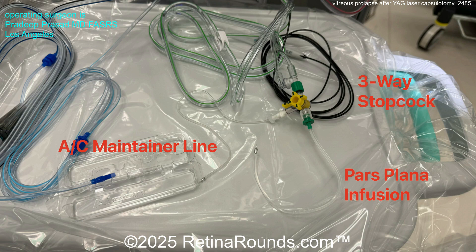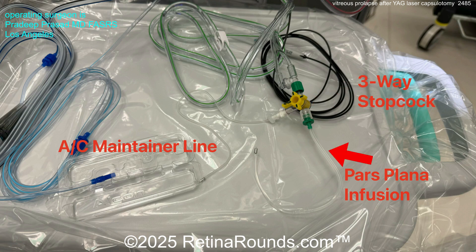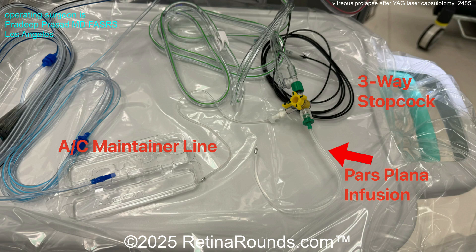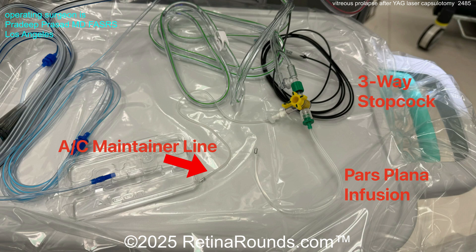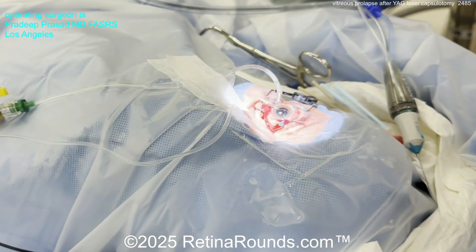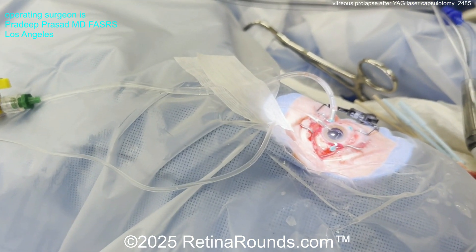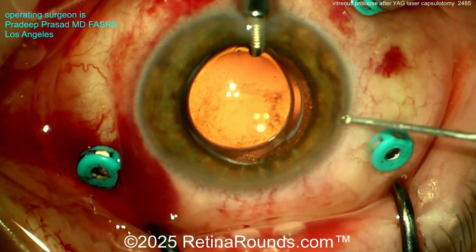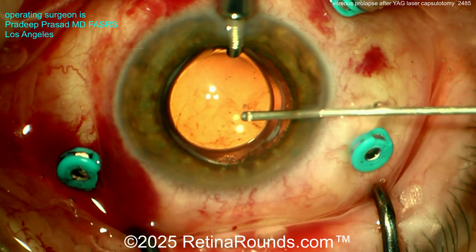The AC maintainer is attached to the same infusion system we're using in the pars plana. You can see the infusion line going to a three-way stopcock — one side goes to the infusion into the pars plana through the trocar for the posterior vitrectomy, and the other side is where the anterior chamber line is located. When we're ready to do the anterior vitrectomy, we just turn that stopcock and we get flow into the anterior chamber.